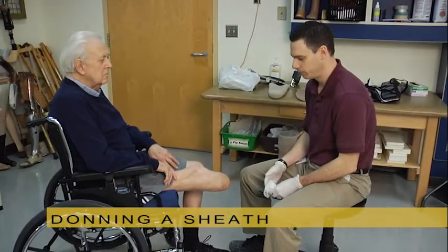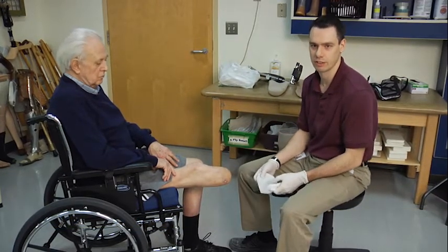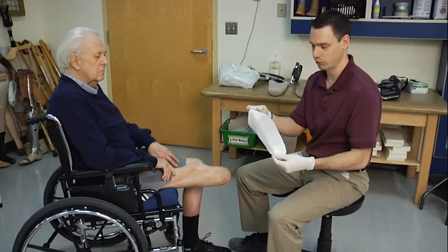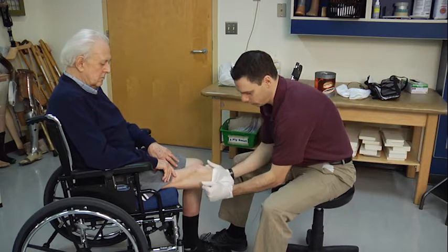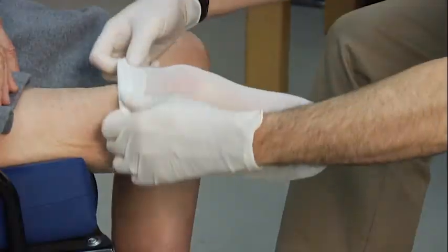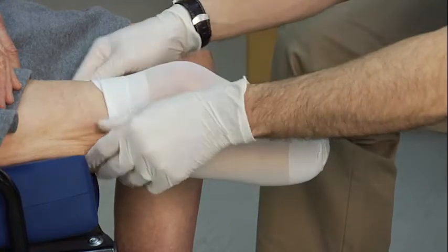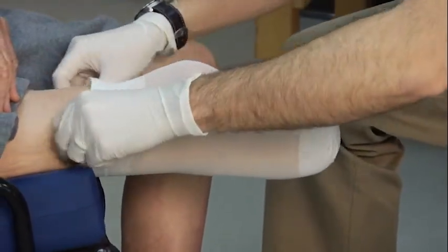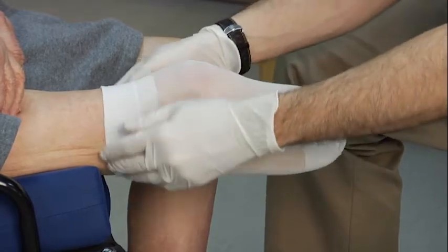First, with some of our patients, they do have a dressing that's covering the incision line and we want to protect that to ensure that the gel liners and the compression socks don't cause any issues. So I'm going to add a white sheath, which you'll see with some of our patients, to protect that. I'm going to pull the sheath on just like you would with a sock. I want to make sure that when we pull the sock on that we don't have any creases, and pull up the toe of the sock as much as possible to eliminate any space so that it's nice and smooth.